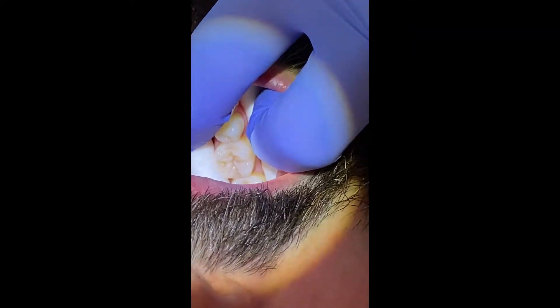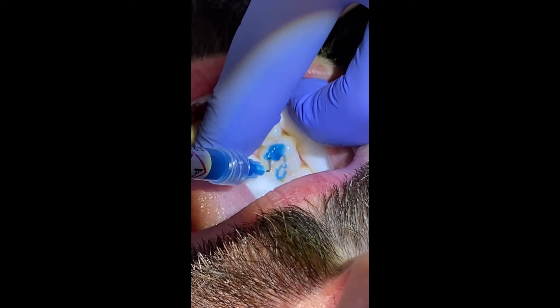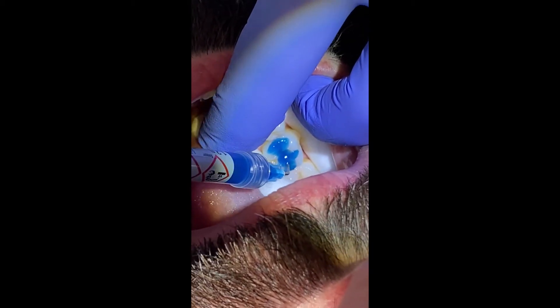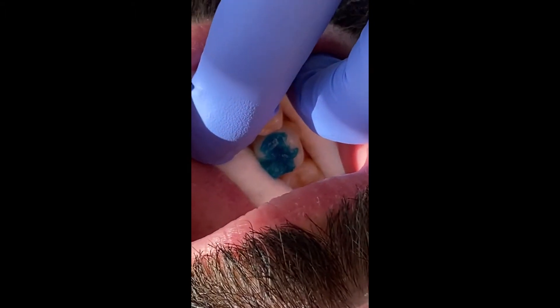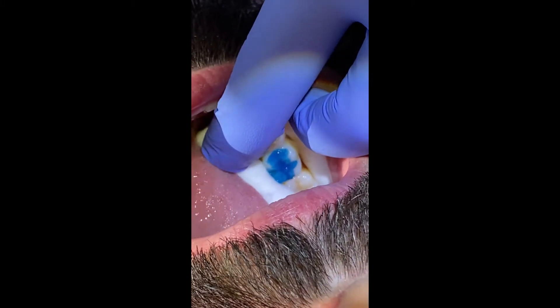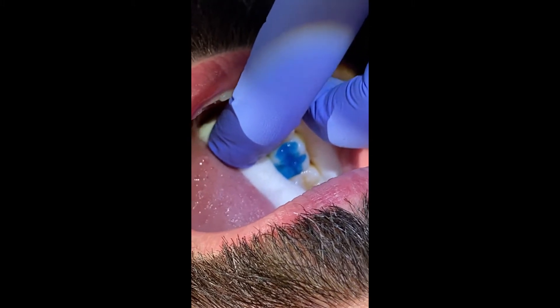We are going to apply a generous amount of etch onto the tooth surface. We're going to try to leave this etch on the tooth surface for about 20 to 30 seconds, depending on the manufacturer's instructions. For us, we're going to be going about 20 seconds. Go ahead and time it.